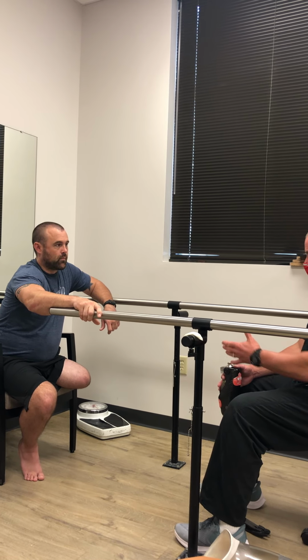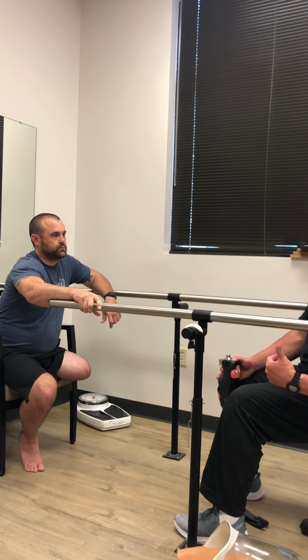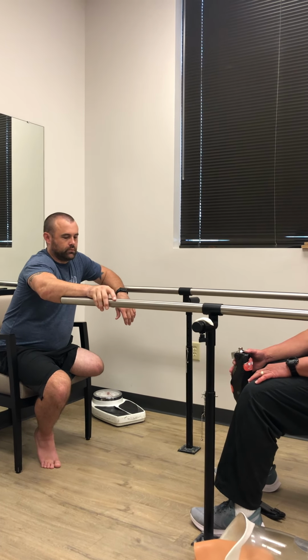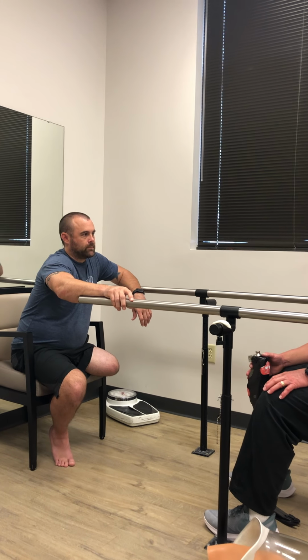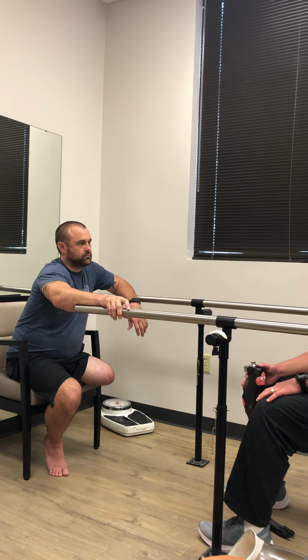And when that happens, then guess what? The socket's custom for you today. It's not custom for you in a year and a half. Yes, it's still custom for Jared, but is it gonna fit the same way? Most likely not. Most people, like I said, Americans, I usually replace everybody's socket, for the most part. If I'm just being totally honest, and I say everybody, let's say 90%.